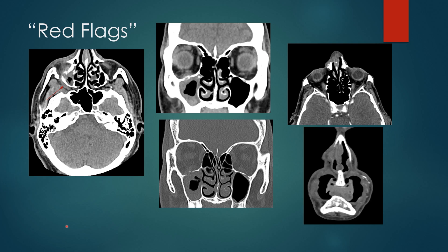Red flags on sinus imaging: if you have abnormal soft tissue or abnormal stranding within the retromaxillary fat in the pterygopalatine fossa, that is an early indicator of invasive sinusitis — often invasive fungal sinusitis. You want to see a nice fat plane behind the maxillary sinus, not soft tissue and stranding. In the same patient, circumferential mucosal thickening and fluid in the maxillary sinus with stranding inferiorly in the orbit — inferior to the inferior rectus muscle — is another reason to suspect invasive sinusitis, confirmed by a bony defect on bone windows.